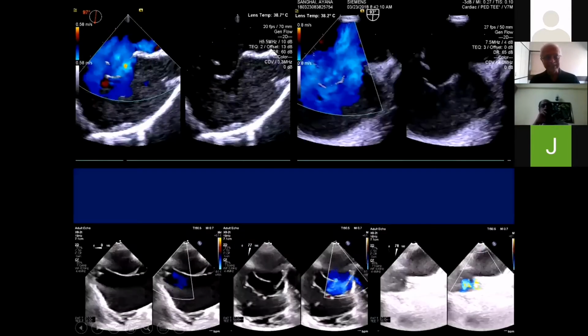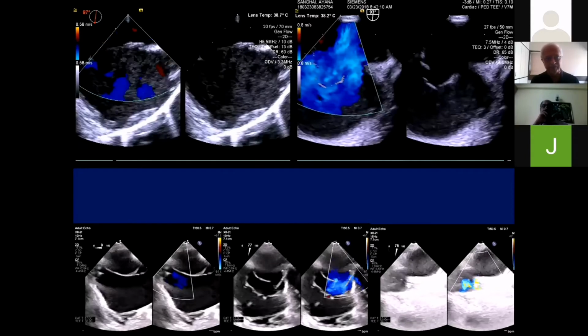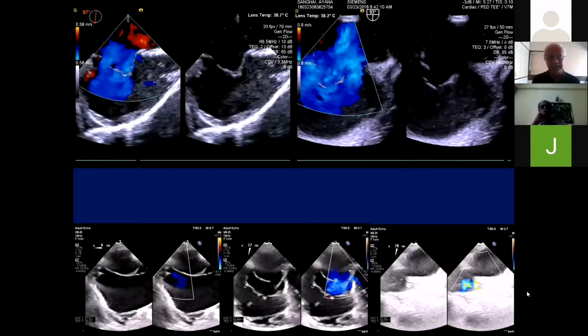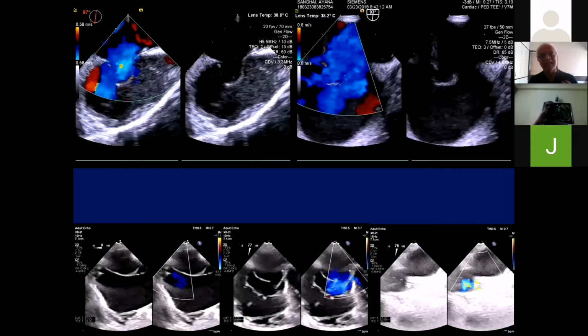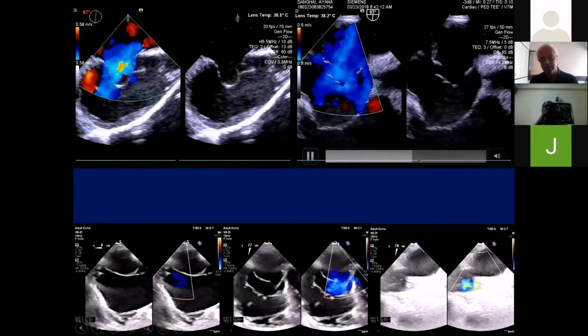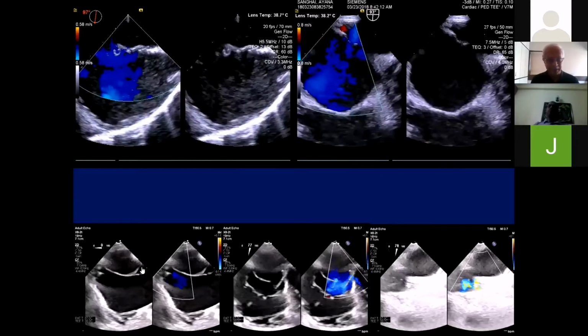This is an example where you have a septum primum which is aneurysmal and there are multiple fenestrations, but septum primum forms maybe 50% or less than 50% of the entire interatrial septum, with septum secundum occupying quite a bit of the space. As against this, septum primum in this patient forms nearly 90% of the interatrial septum, with just a tiny little septum secundum here. And you can see that there are multiple fenestrations all over the aneurysmal septum primum.